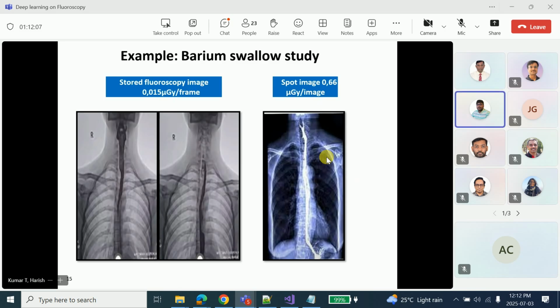Initially, I was expecting it to be segment level, where small segments are captured in multiple frames and finally attached into a single bigger frame. No. That is also a way, called a conventional angiogram, that they do in cardiac. They can also do it for the rest of the body. That is the conventional way. When you inject at a particular place, you capture the image and keep it. You cannot stitch it later. You can do it individually.